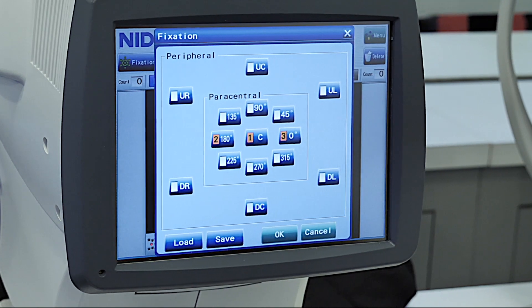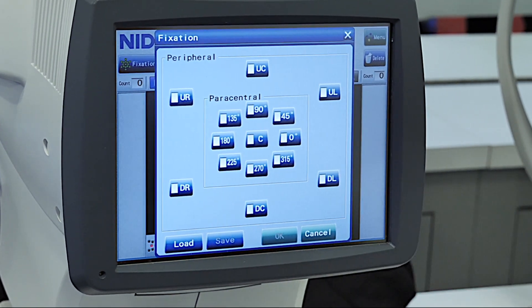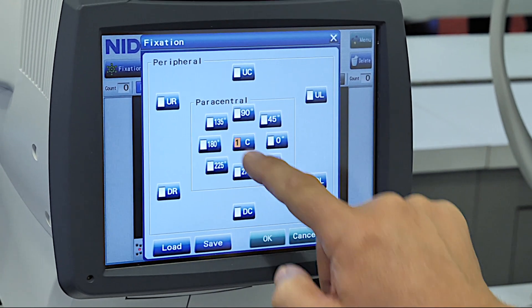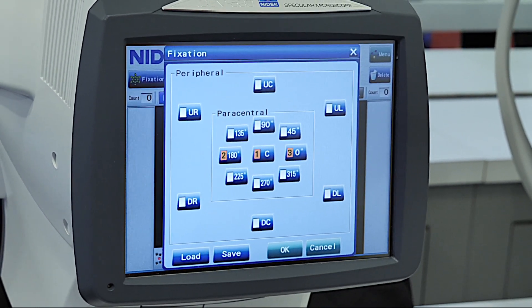First you're going to select the fixation points that you want to evaluate. We can image central, paracentral, and peripheral. We can select one, or we can select three, or we can select all of them.